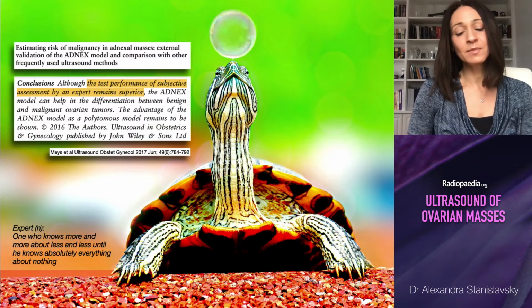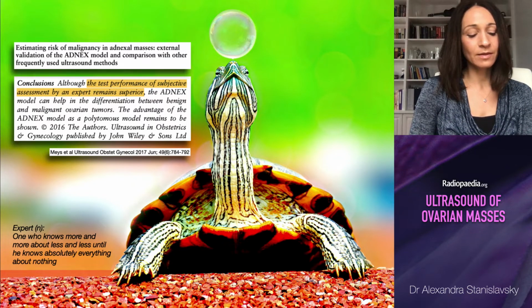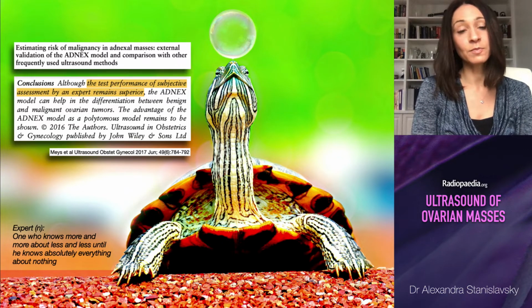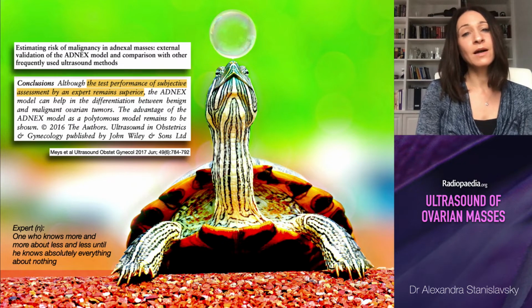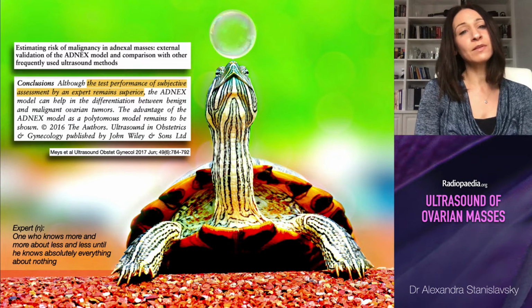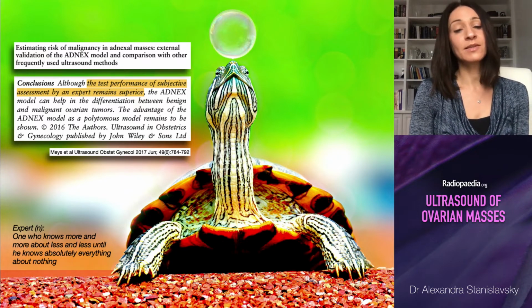The risk assessment models that I've been talking to you about have been the subject of a vast amount of research, both internally within the IOTA group, but also through external validation. This is something that I wanted to point out from one of the large analyses which assessed the ADNEX model and compared it to other frequently used ultrasound methods.